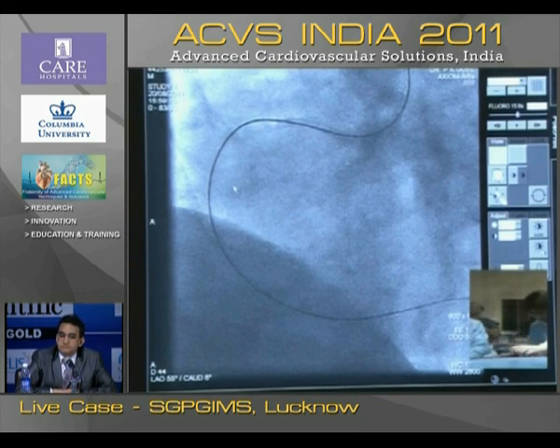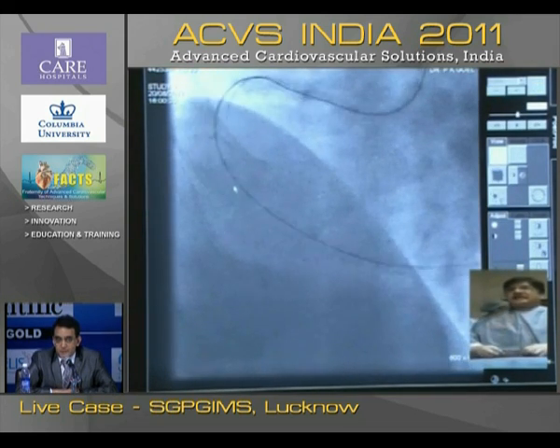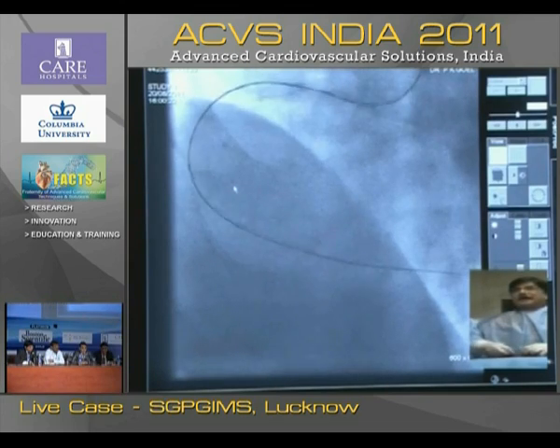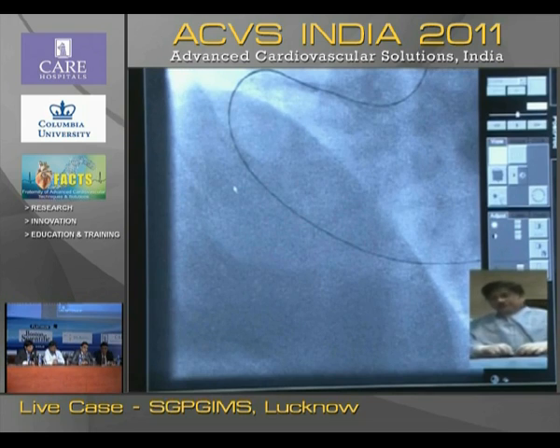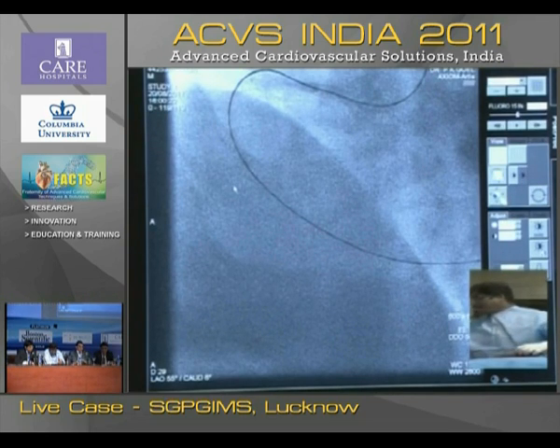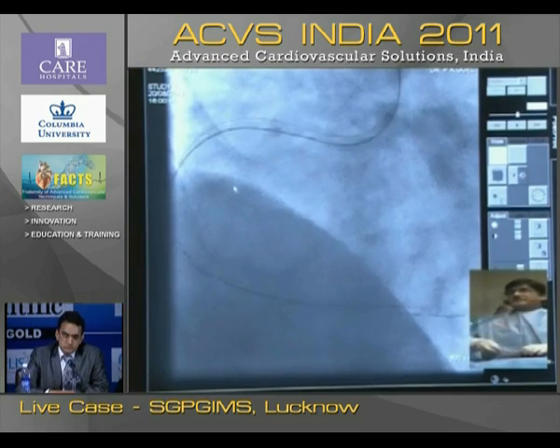Anyway, Sharat, I'll tell you one thing. To check whether it is in the correct lumen, I believe on the angiogram and my orthogonal viewing, and that is what I was trying to show you. I somehow am reluctant to do an injection in the distal artery, because if it is not in the true lumen, then you had your day. Then you will not be able to do anything. You get my point? Not necessarily. So you know, that is the thing. So I don't do that. I know some people.